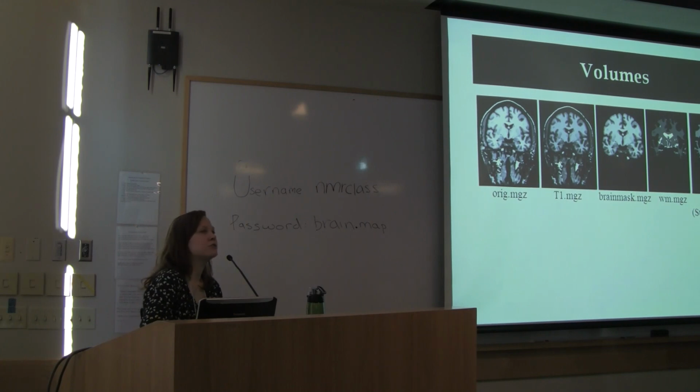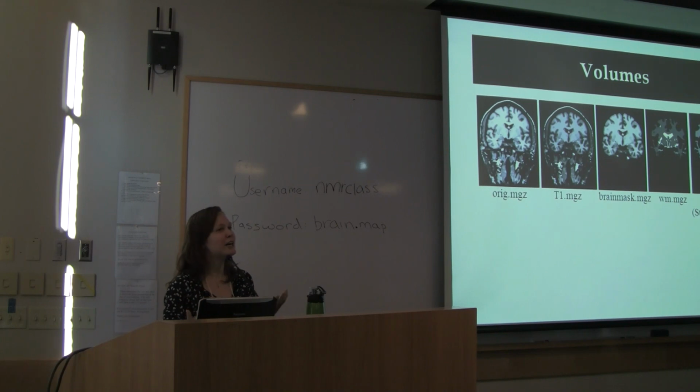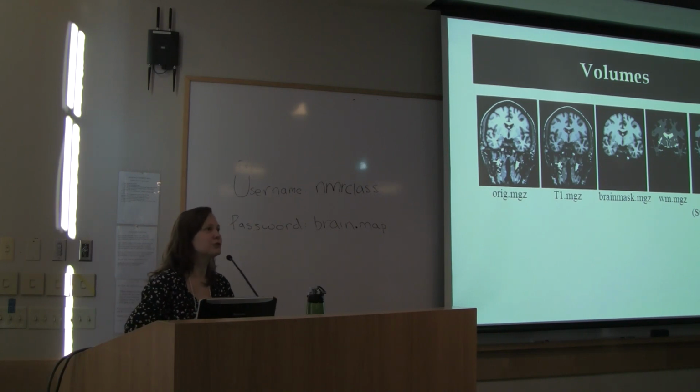We'll also use the term volumes a lot, and we are usually not referring to the measurement volume. We're usually referring to files. This is an example of several files that we'll call a volume. And these are different outputs from FreeSurfer. Usually they have the MGZ extension and they look like MRI data. So when we say check your volume or bring up your volume, we're probably referring to one of these.